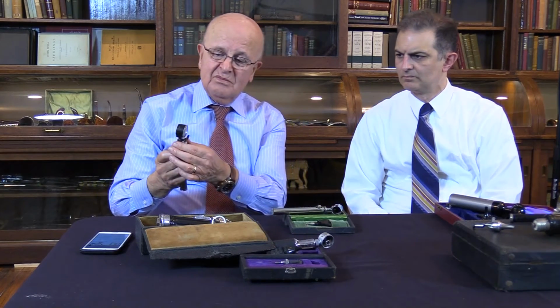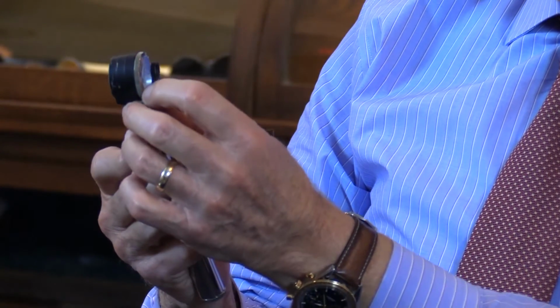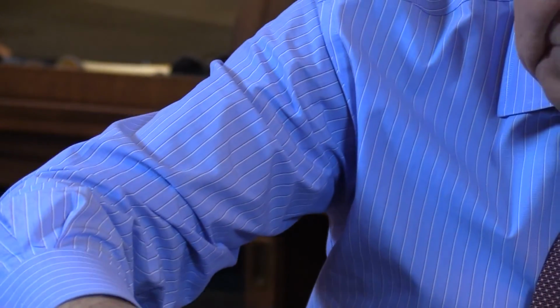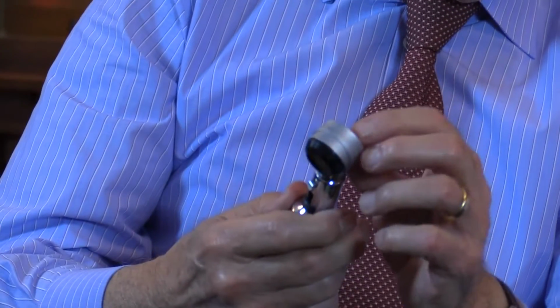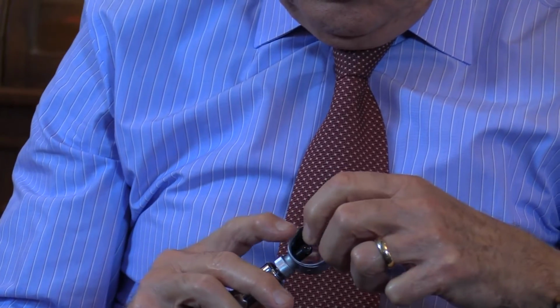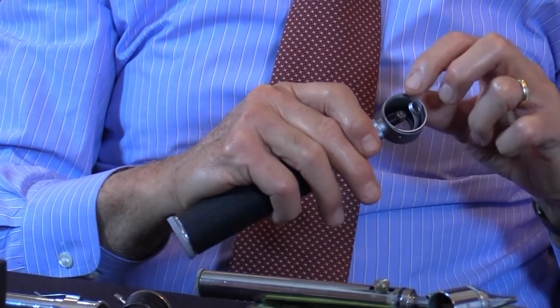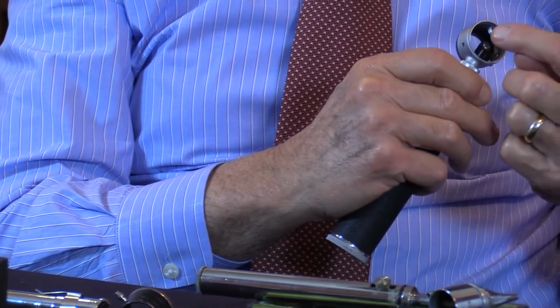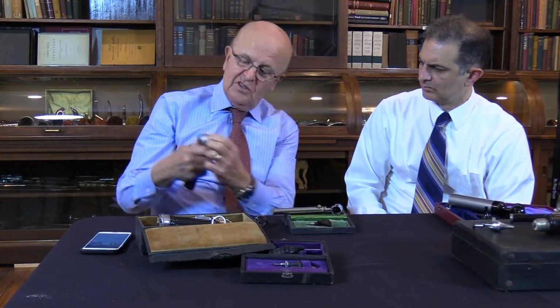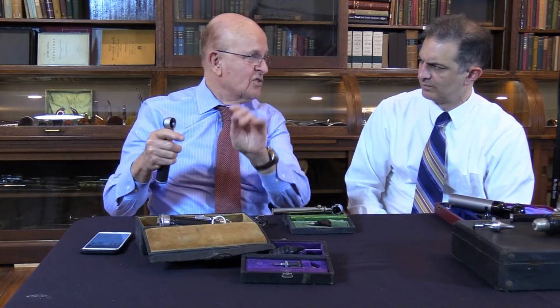Then they got this kind that has a lens that you swing, and you have a double lens, so the magnification will be better. Now this is the most fascinating, Joe. This here, they have a lens that you can take out of the way, and you can see the light here and a lens on top of the light. But if you want to concentrate the light more, they developed this lens that you swing over the light source that can concentrate the light more.